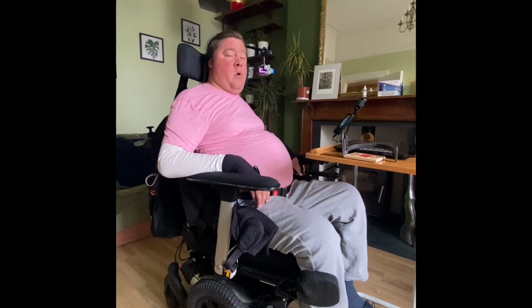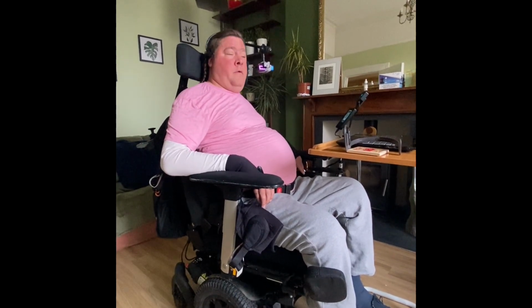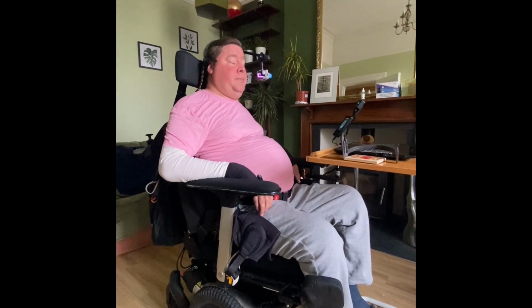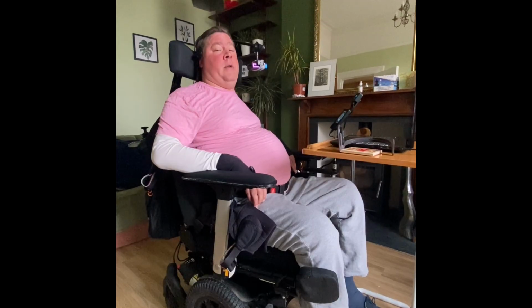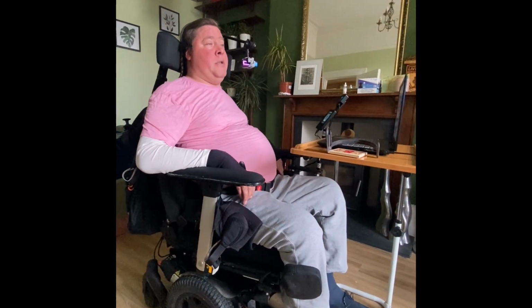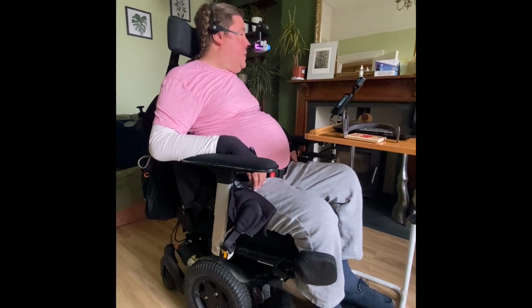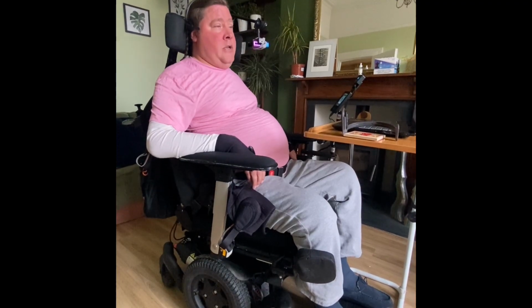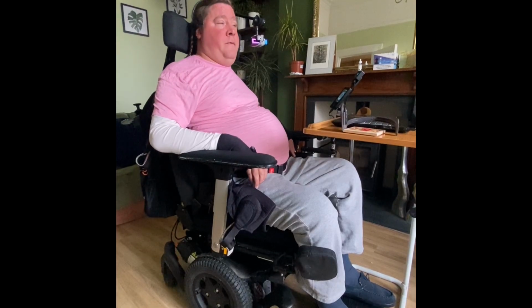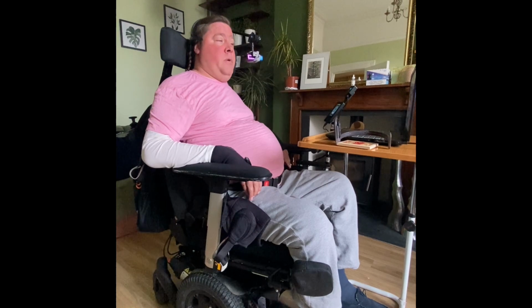I myself broke my neck 4 years ago and am now a quadriplegic. One of the fundamental issues is accessibility to space. I have currently, in what I'm sat in, a wheelchair that I am able to power myself, that does give me a fair bit of independence. This headset that you see on my head has a gyroscope mapped to a drive function for the motors, which allows me to move the wheelchair through head movements.